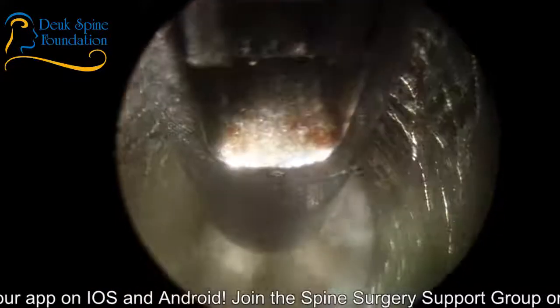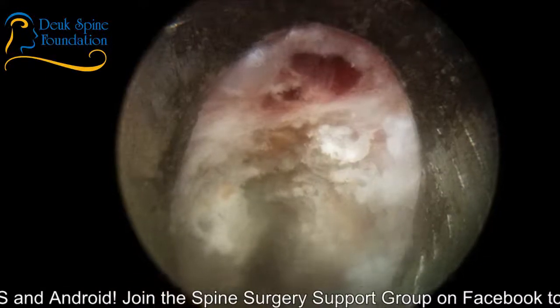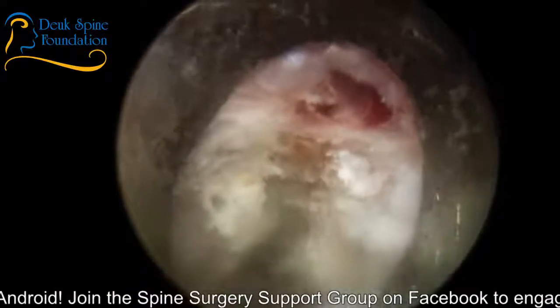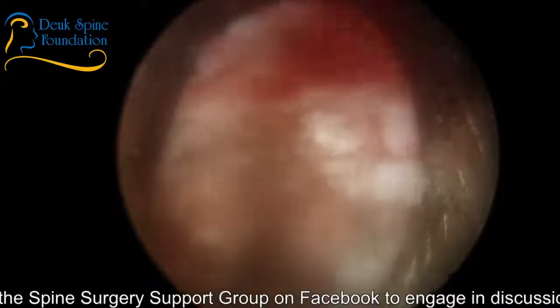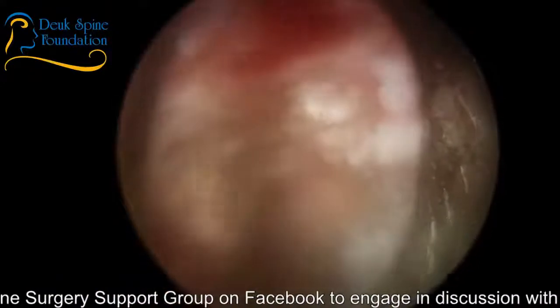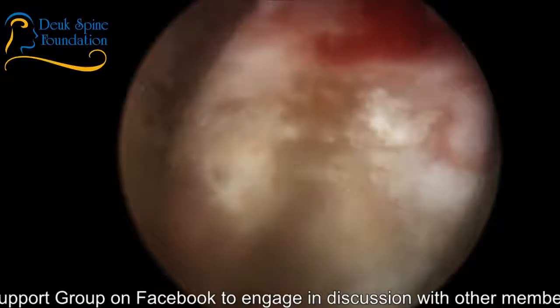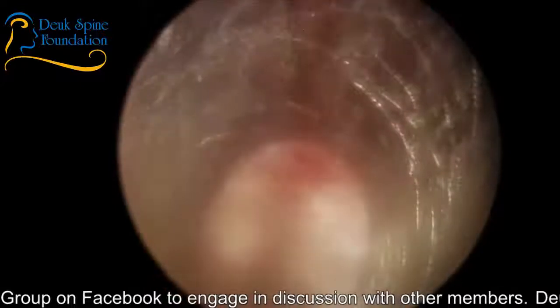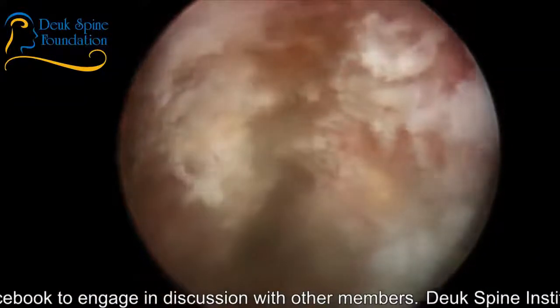So look what happens when I put the grabber down. It actually stops the bleeding. Isn't that amazing? So I can get a good view of what I need to work on, and then I take the grabber out and it starts up. And the reason for that is it creates back pressure and the fluid coming out. Whereas if you don't have the back pressure, the irrigation just keeps pulling the blood out. Anyway, it's a little trick I've just showed you.